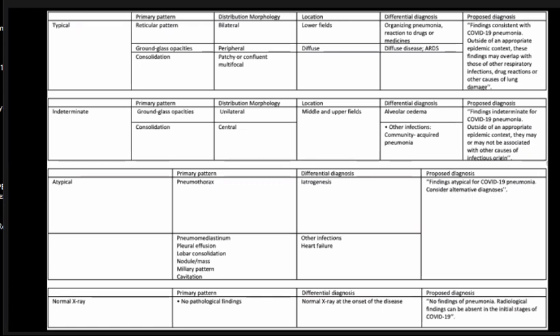This is just a summary of what I have discussed. This is a classification of COVID-19 findings on chest X-ray, and this is based on an article by Litvanovich et al.